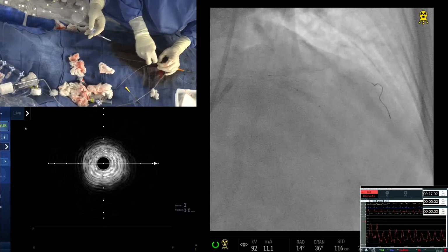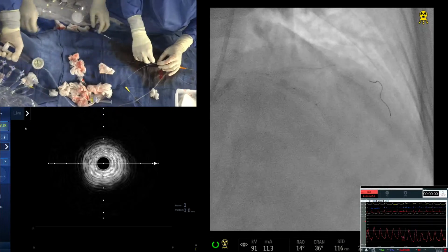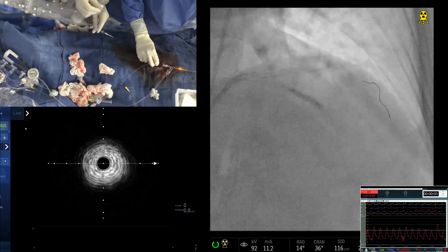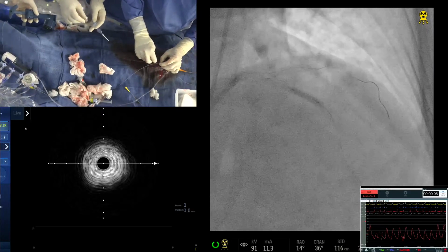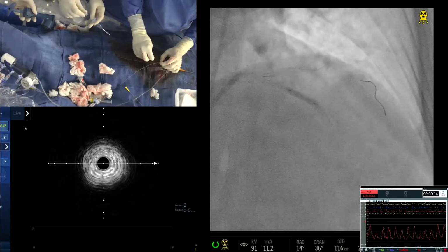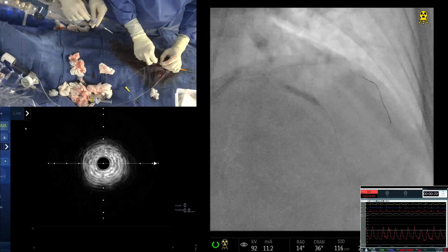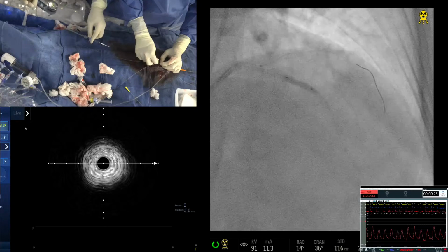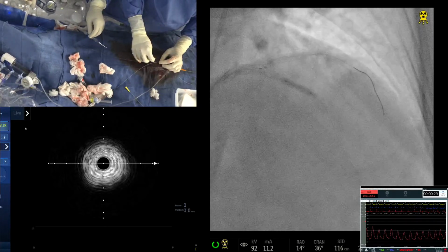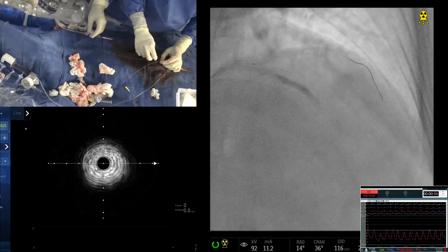Yeah, good. We'll be okay. 1.0. I know it'll go. It will not go. Go a little more. Anchor. Okay. Good. So it's making that angle there. Very sharp angle. Want to go with a balloon or no? Which balloon? Okay, now you can go and see if it opens up. Okay. Go. Ruptured? Ruptured.